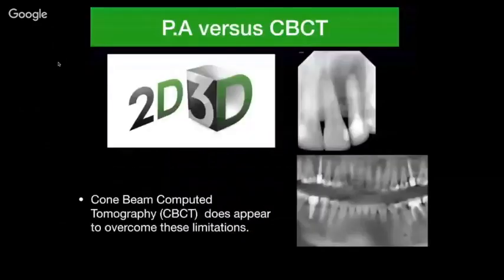However, those two kinds of radiography have limitations, because they are an image in 2 dimensions. And this limitation will omit the 3rd dimension, which is very important for us to evaluate the case, the situation, and to develop the treatment plan.